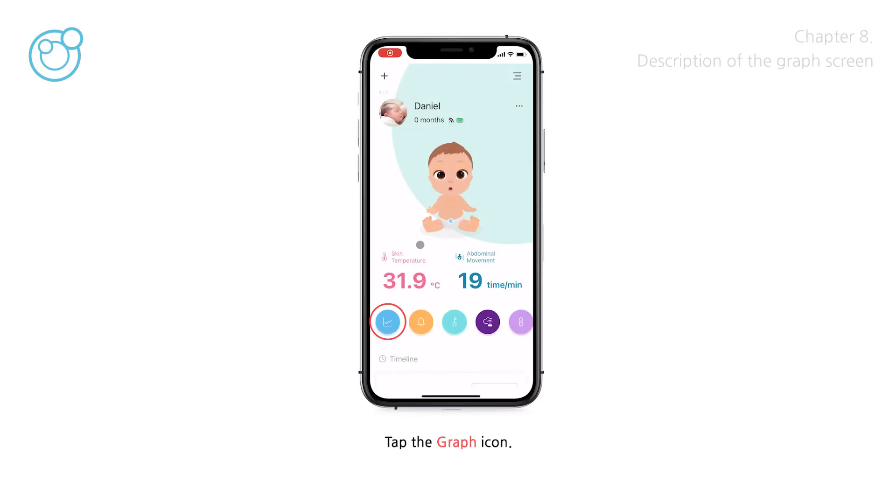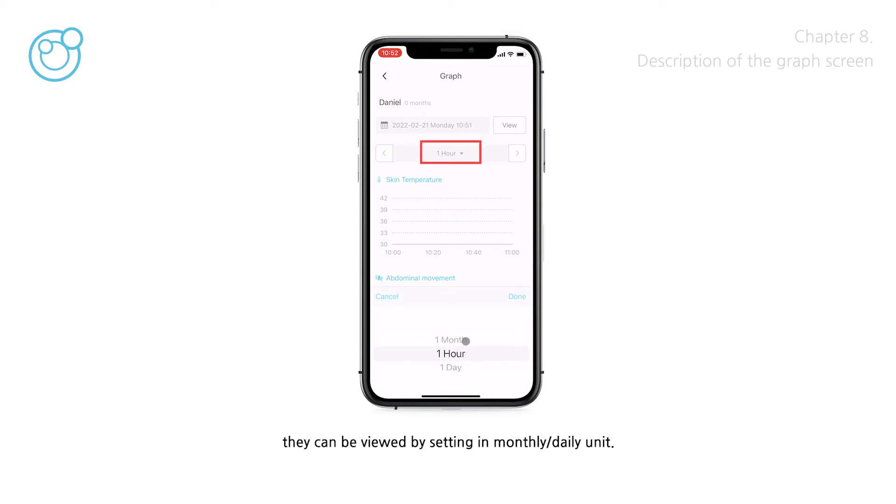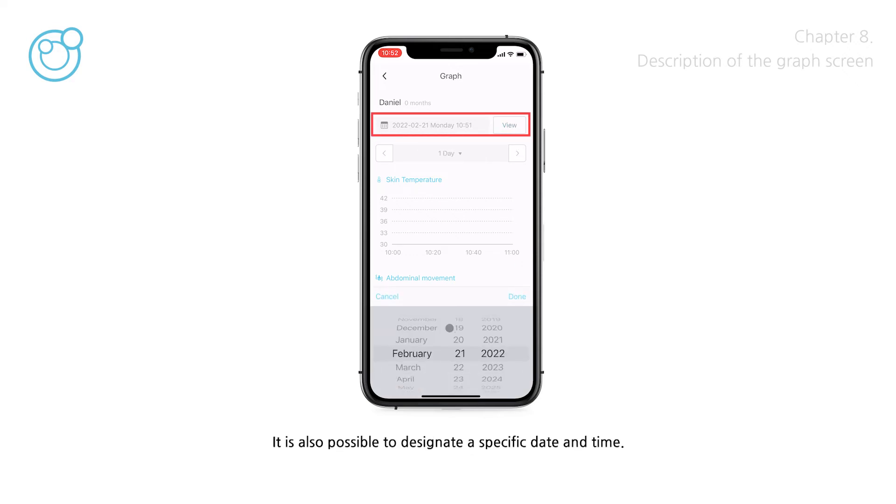Tap the graph icon and graphs per measurement item will appear. Graphs can be viewed in an hourly unit by tapping the left and right buttons, and they can also be viewed by setting a monthly or daily unit. It is also possible to designate a specific date and time.